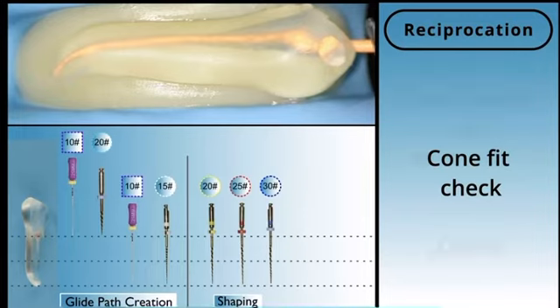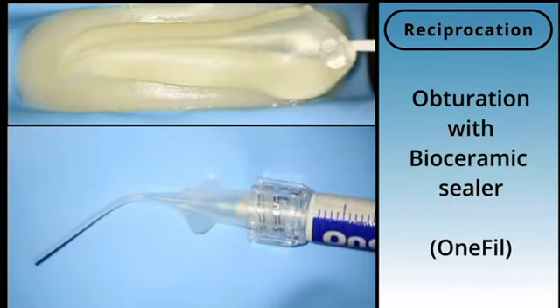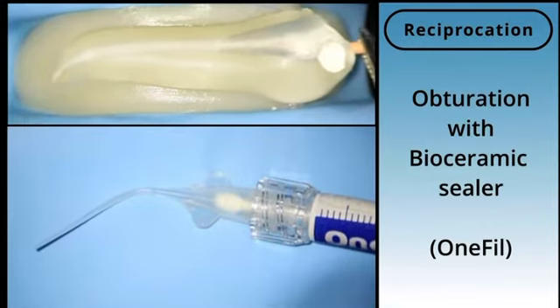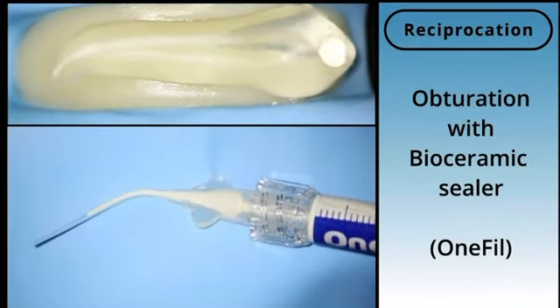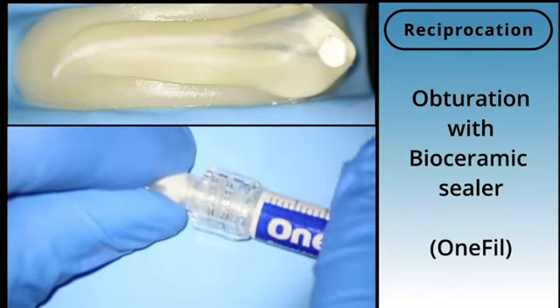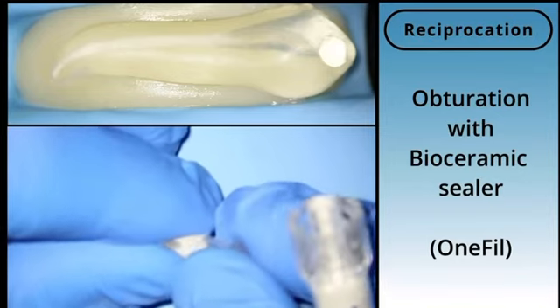And again, for cost effectiveness, what we do here is we squirt a little bit of the bioceramic into the tip, and then we dip the GP cone into this, and we always do a double dip. The first dip is just to coat the walls, and the second dip is to make sure all the bioceramic sealer is pushed to length.